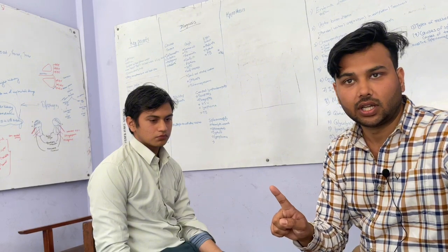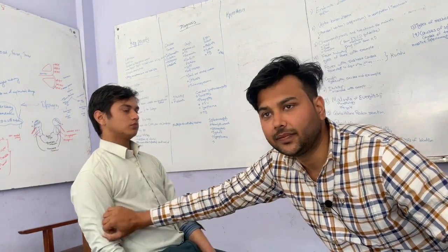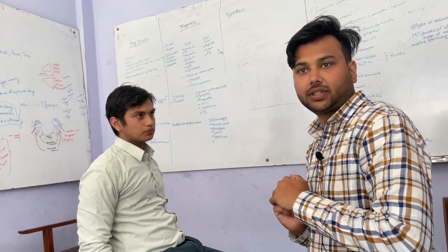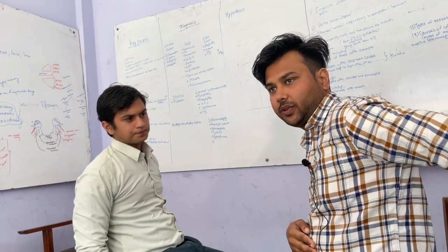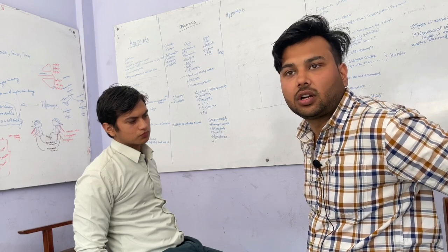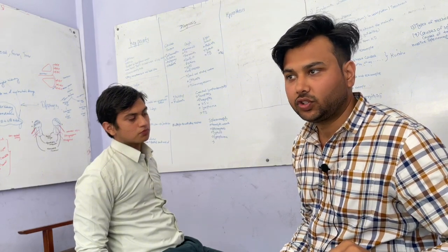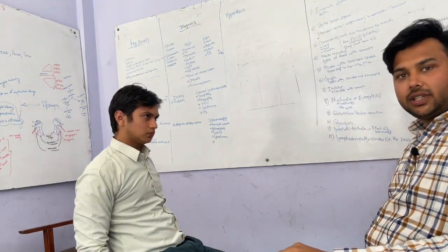It's very important. Another thing is, while he is sitting, his back should be well supported by the back of the chair. The patient cannot sit like this while examining blood pressure. If his back is not supported by the back of the chair, he is using the muscles of his trunk, and if those muscles are under contraction, the blood pressure reading can be erroneous. So make sure the patient is sitting and the patient's back is well supported, right?